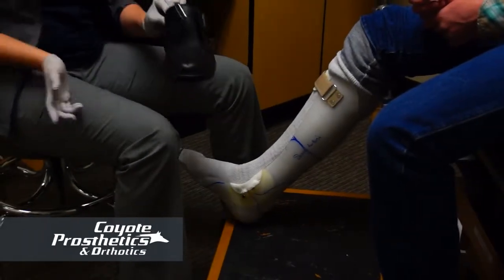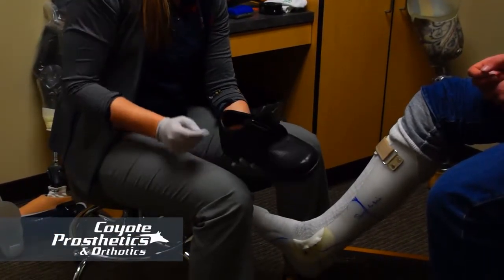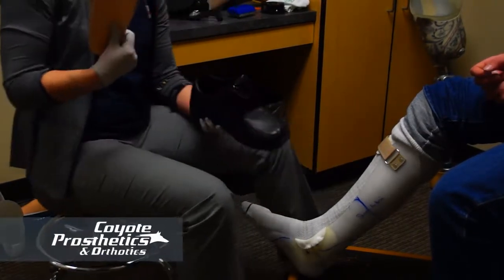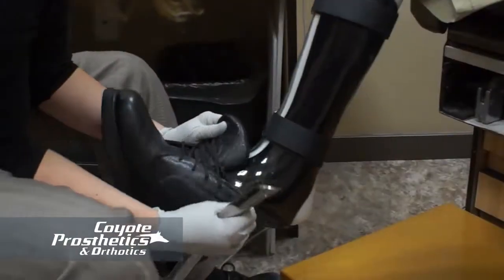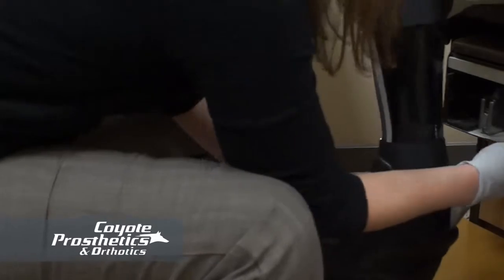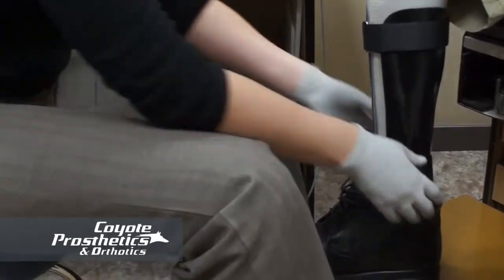For the shoe, you want either a lace-up or a Velcro shoe. Make sure it has a removable insert as well — take the insert out to give a little more room for your foot and make everything more comfortable. Slide the shoe on like you normally would. You may need to use a shoe horn in the back to help get it over the heel, as that tends to be a trouble spot.